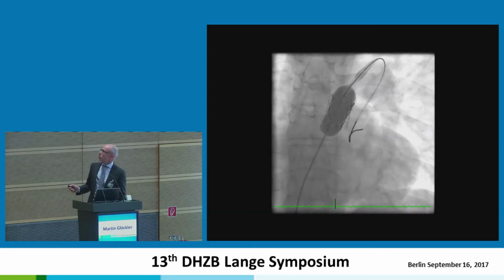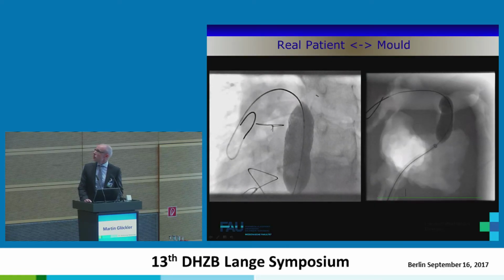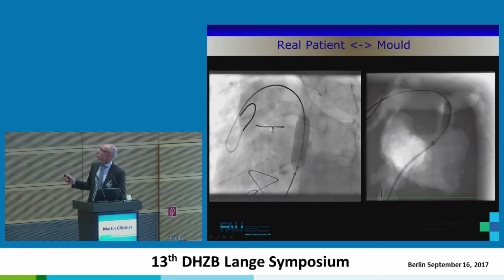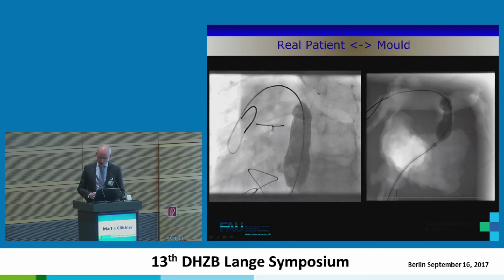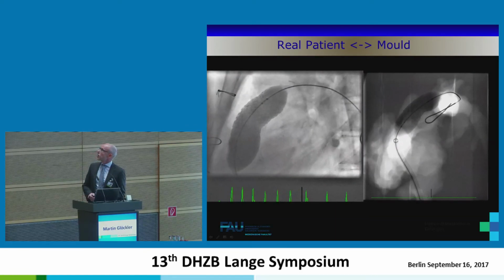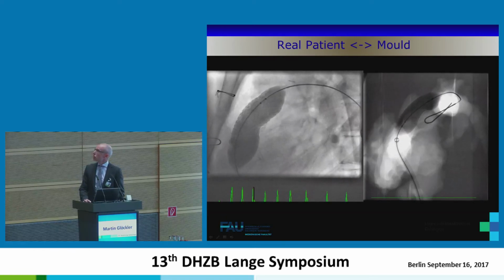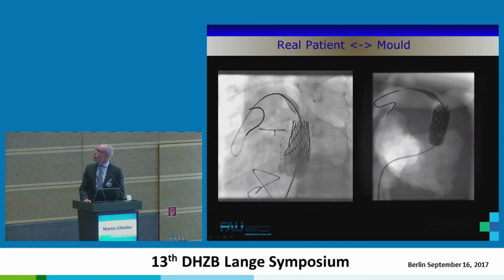That's the same patient, but during real catheterization, so the images are very comparable. That's another patient with a narrow outflow tract, but not an outflow tract, a stenosis just before the bifurcation. That's the real catheter, that's the model. That's the look from the B camera. The silicone reacts a little bit like normal tissue. And finally, the implantation of the Melody valve.